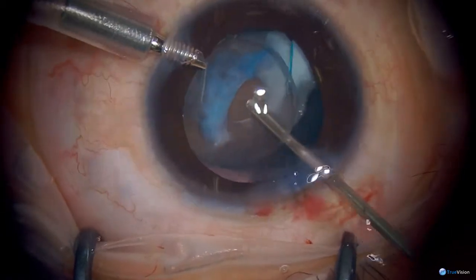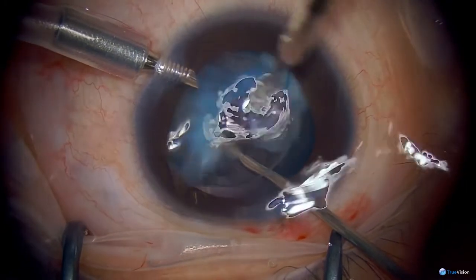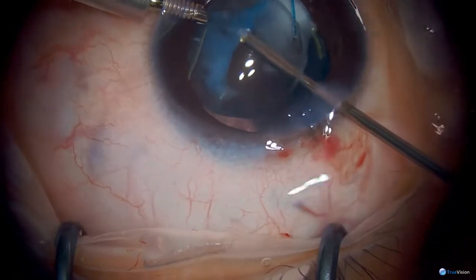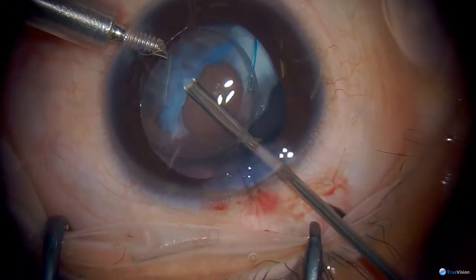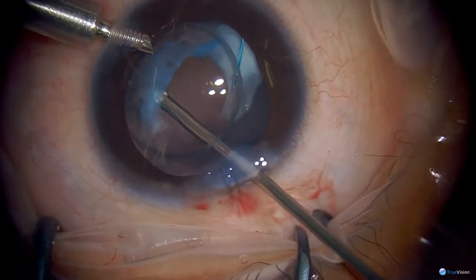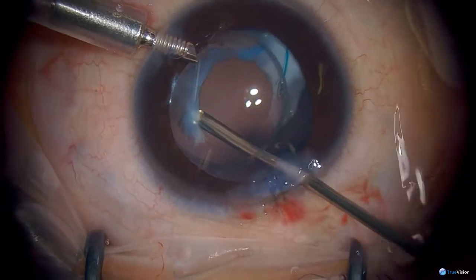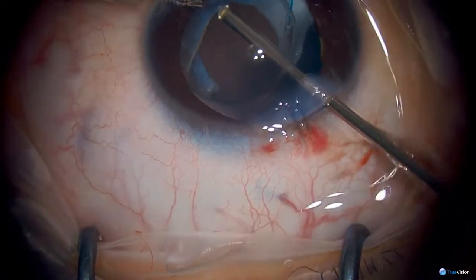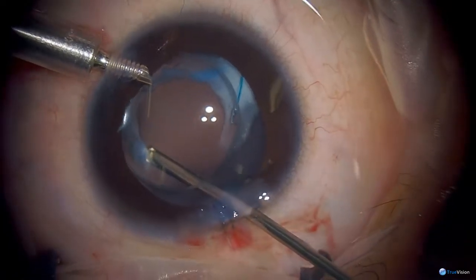So you work around the edges to enlarge the posterior opening. I just asked a question about the size. You don't need to remove all of that white material. You just have to remove enough that you can safely place the IOL behind it and capture it inside. That fibrous material really helps to stabilize the IOL.